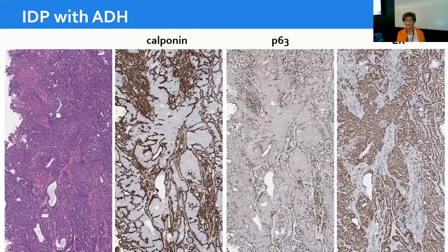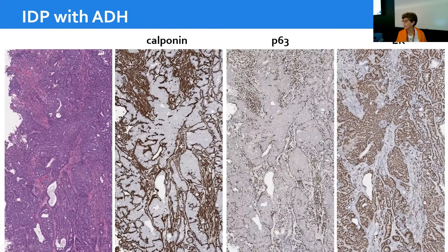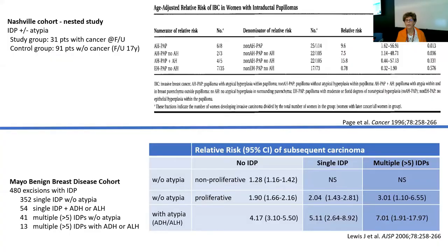Here is another example of an intraductal papilloma with ADH. Calponin and P63 help visualize the fibrovascular cores so you can better appreciate the extent of epithelial proliferation. In this case, the epithelial proliferation occupying these spaces is very uniformly and diffusely positive for ER, supporting the diagnosis of intraductal papilloma with ADH.